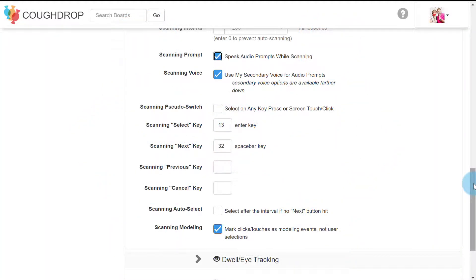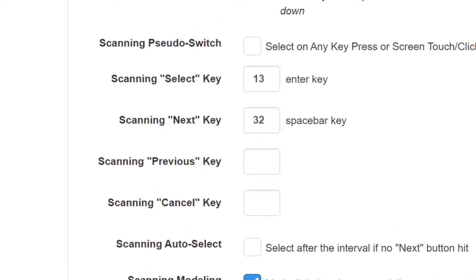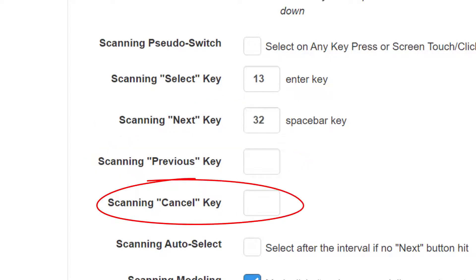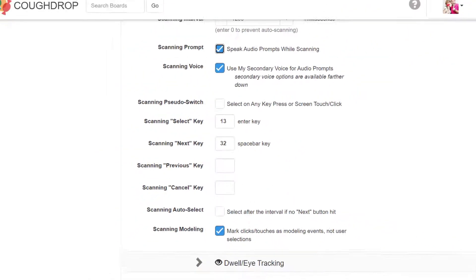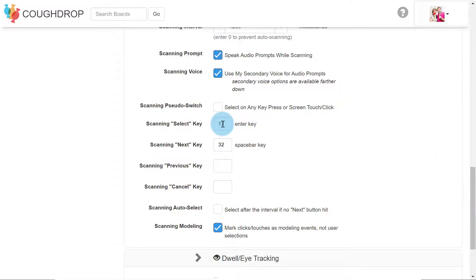You can assign up to four switches to perform functions while in scanning mode with CoughDrop. These functions include select, next, previous, and cancel. You can choose to connect a switch or keyboard button for all of these functions or only for the select or next function and then any other options. You must set a switch or button as select or next in order to use scanning mode.